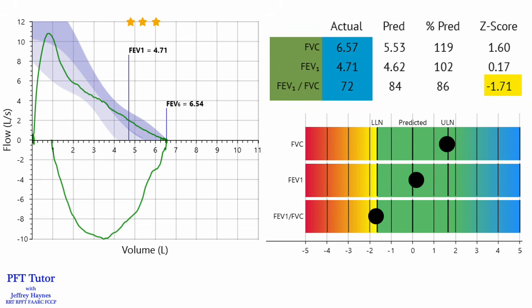So in this case, in a patient who's never smoked and doesn't have typical asthma symptoms or risk factors, my feeling is that his spirometry probably doesn't indicate airways disease, but rather dysanapsis. It just takes longer for him to exhale his large vital capacity through normal size airways, and this will lower his FEV1 to FVC ratio. Of course, it would be wise to follow this patient over time to see if he does develop asthma later in life.